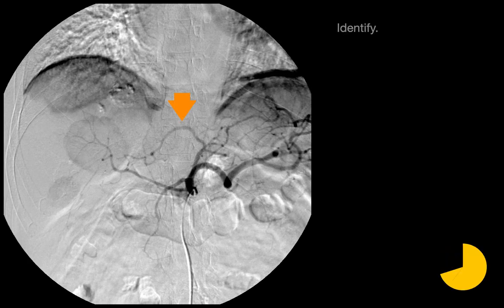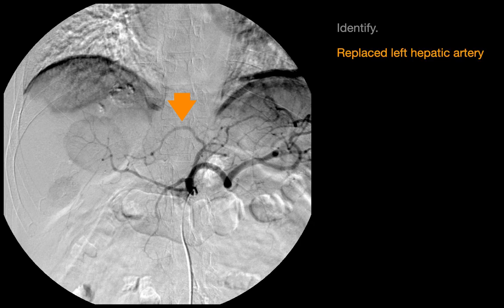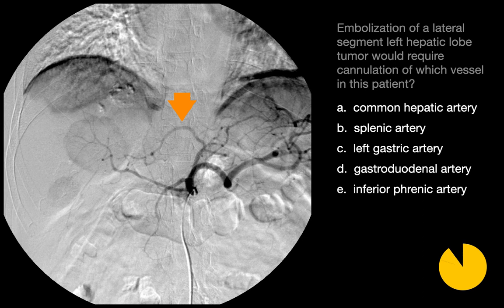This vessel is a replaced left hepatic artery. Embolization of a lateral segment left hepatic lobe tumor would require cannulation of the left gastric artery, which would provide access to this replaced left hepatic artery.